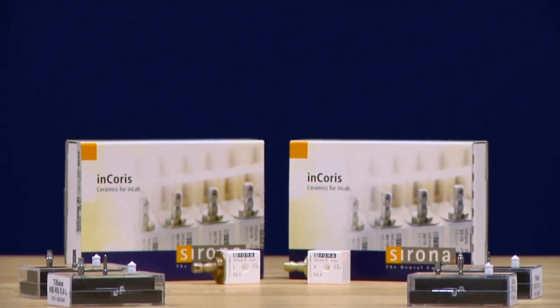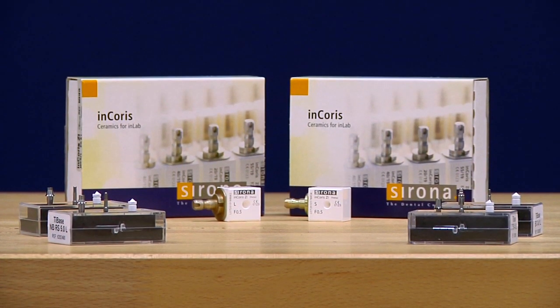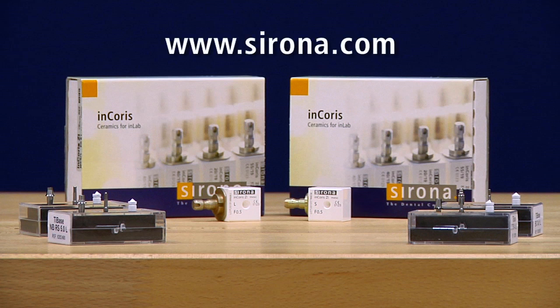Sirona offers implant kits that correspond with most implant systems from Nobel Biocare, Straumann, Biomet 3i, Astra, and Friadent. For a complete listing of implant systems, please visit www.sirona.com or ask your Patterson representative for more information.